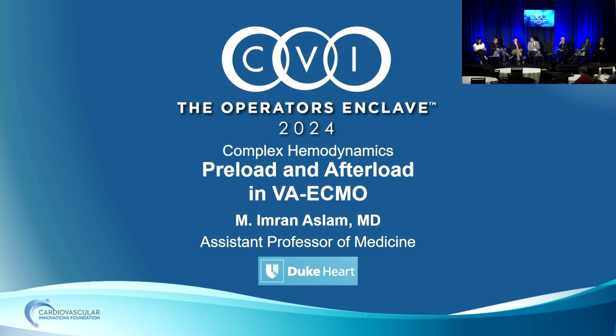Yeah, the presence of a dyskinetic septum, if you had done an echo before, would have helped you make a decision whether to go Impella or ECMO. Because if there was a dyskinetic septum, you could expect it to improve with Impella. But with just biventricular dysfunction, Impella alone was not expected to improve the condition.